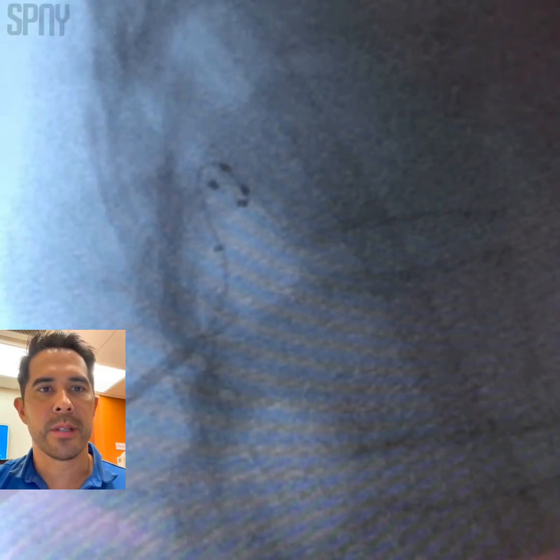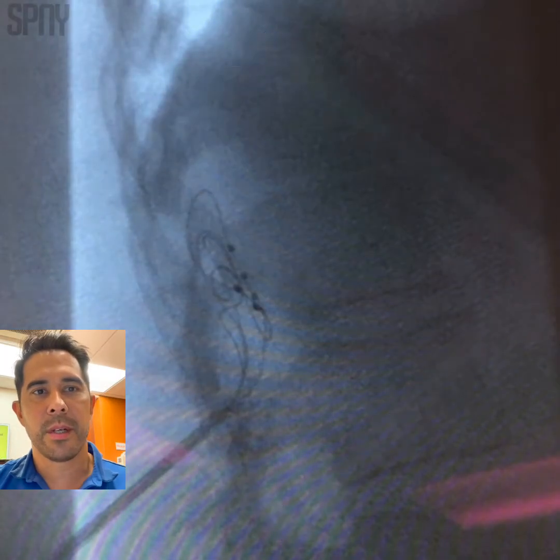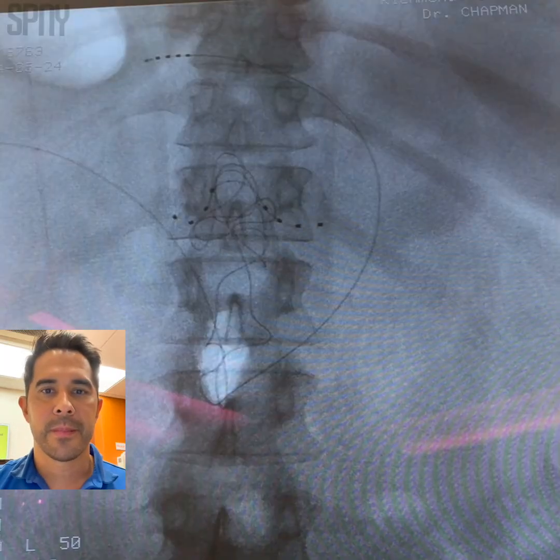There's our one lead, and we're about to have both of our leads in place — that's the placement. Hope you guys enjoyed it.